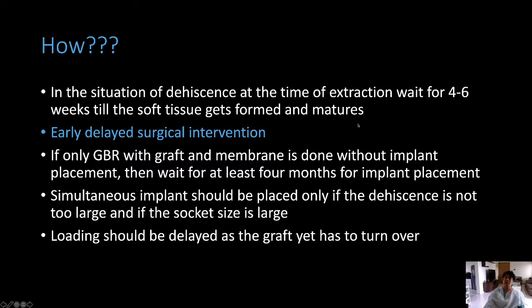And why should you not promise before the surgery? Because if you promise before the surgery, then there is always a gun on your head. It's better to tell them that yes, I'm going to graft for sure. I don't know if I find the condition is conducive in the surgery, I will place the implant, otherwise not.